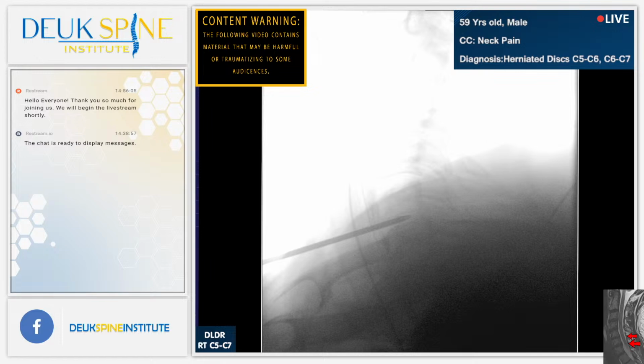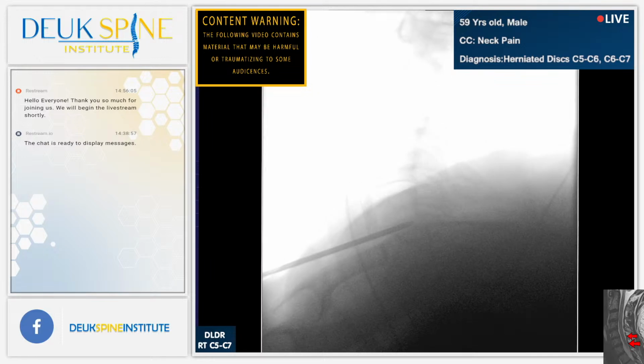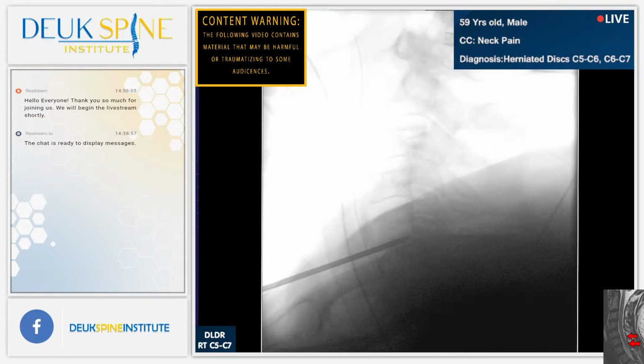Crazy, huh? We have the MRI over there. It's very odd. Shot? What do you think, Luis? A little further, right? Just a little bit? I mean, we're right there, right? I think we're almost there. We're just a millimeter away. I want to look at that MRI in a moment. 4 millimeter tube. We're going down to the disc. We'll go through the disc along the shaft of the dilator.